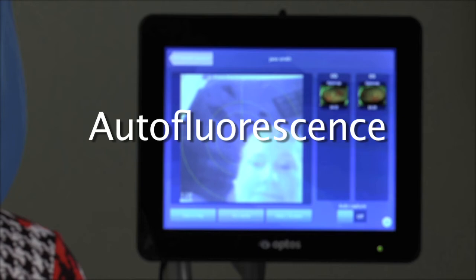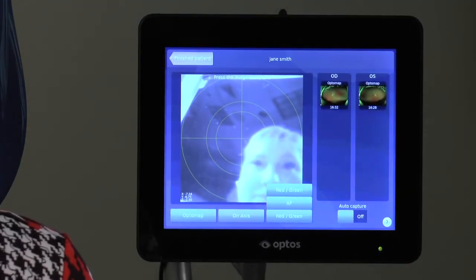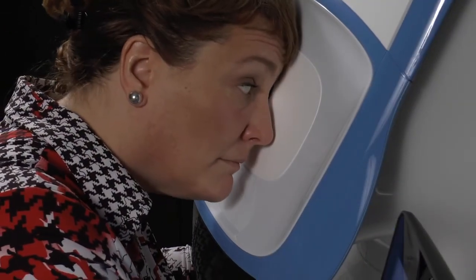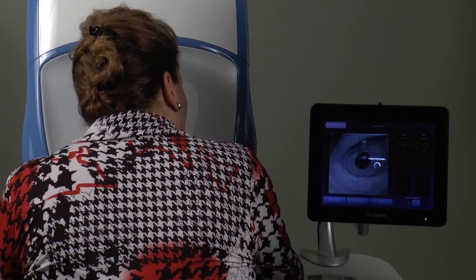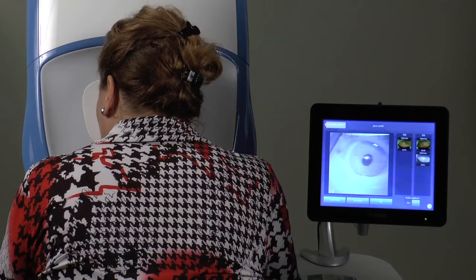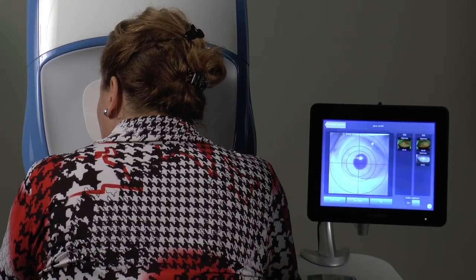To capture autofluorescent images, tap the button labeled red-green, then select AF. Instruct the patient to align themselves in the same manner as for color images, reminding them to keep both eyes wide open as they center up the target and slowly press inward until it turns green and an image is captured.